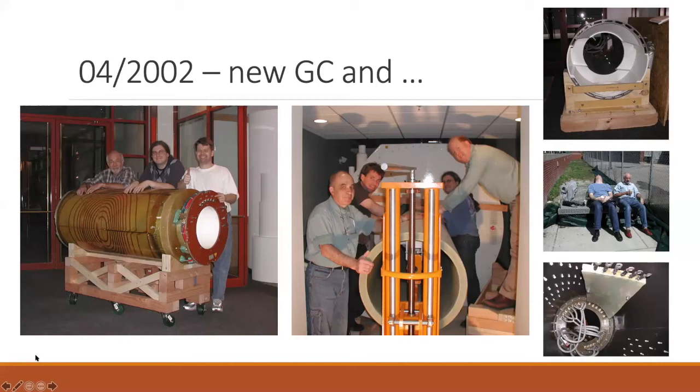On this one picture on the side, you also see how exhausting it was, that Graham and Wilfried had to take a small nap. On the bottom, actually, you then see one of the shells we also built here at MGH. It's our own design. It was a shell in which the gradient leads were put, and the idea was to make it as rigid as possible.